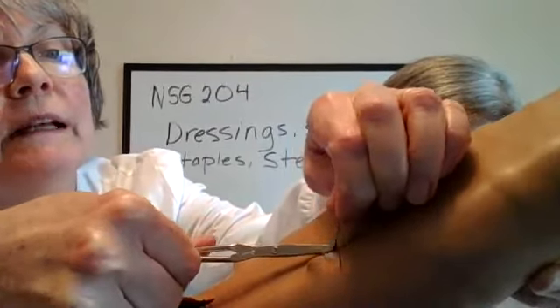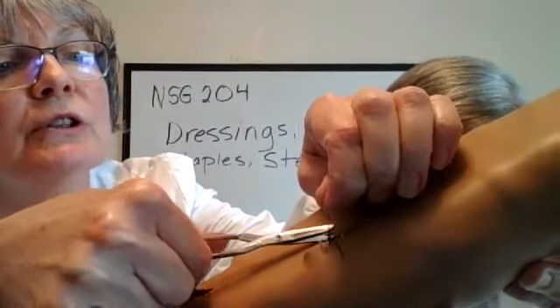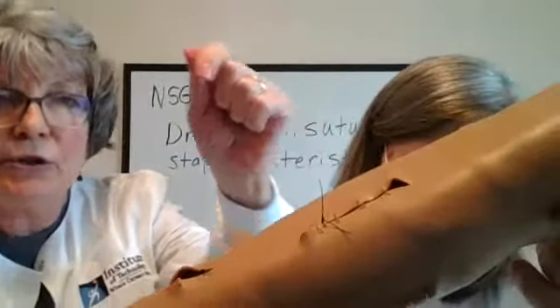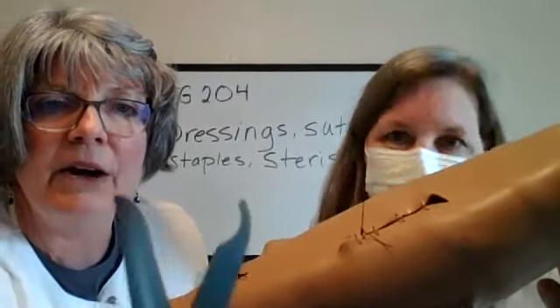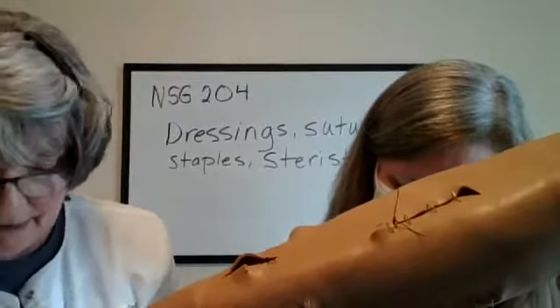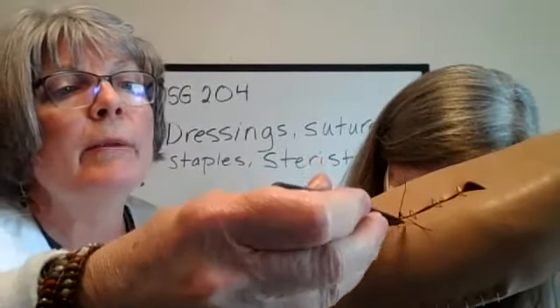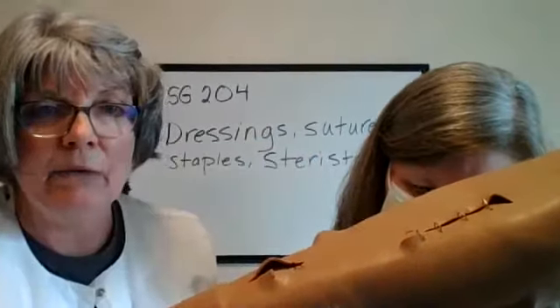Oh, Karen did a great job of suturing. You got this nice and snug. So it goes, there we go. So it slips underneath. That's why there is that little half moon right there, because the suture is cradled right in that little notch. And then you snip it, and then with your forceps, you want to grab hold of the knot here, and you should be able to then just pull it out.